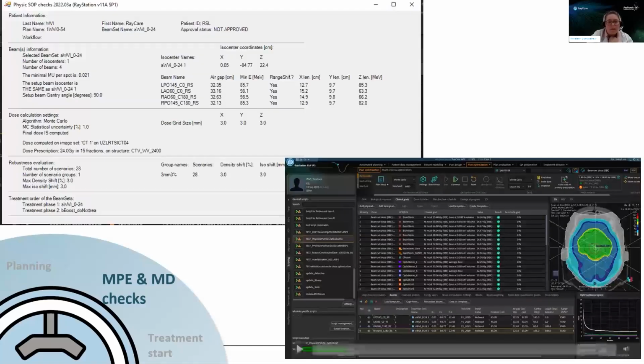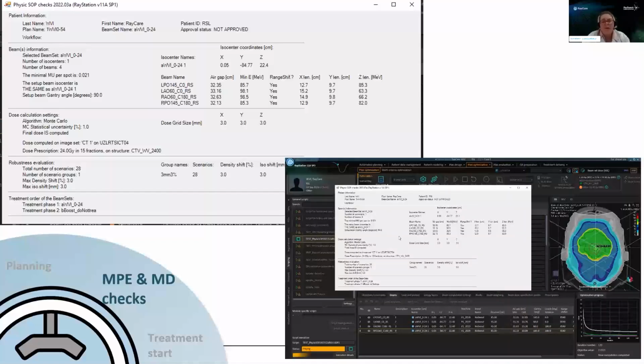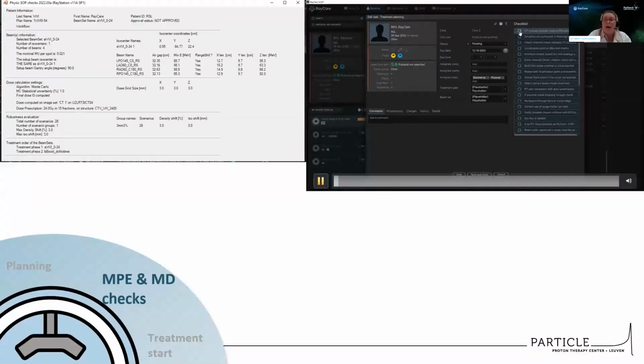To speed up the step, we found it really handy to have a plan overview using, again, a RayStation script. Let me show you how that's run. So we just load that script, and it basically prompts a pop-up where we can check some general plan parameters all in one screen. So we see the amount of beams, the min and max energy of each beam, minimum MU, dose grid settings, dose grid size, robustness parameters for evaluation, setup beam information, approval status, SLC plan CT information. So a whole bunch of information just in one pop-up. And the advantage of using the script is that we can basically check off half of our questionnaire with this one overview pop-up.